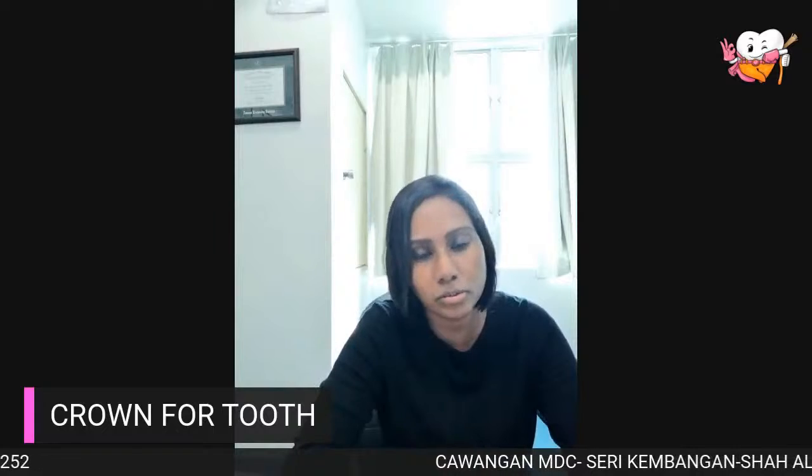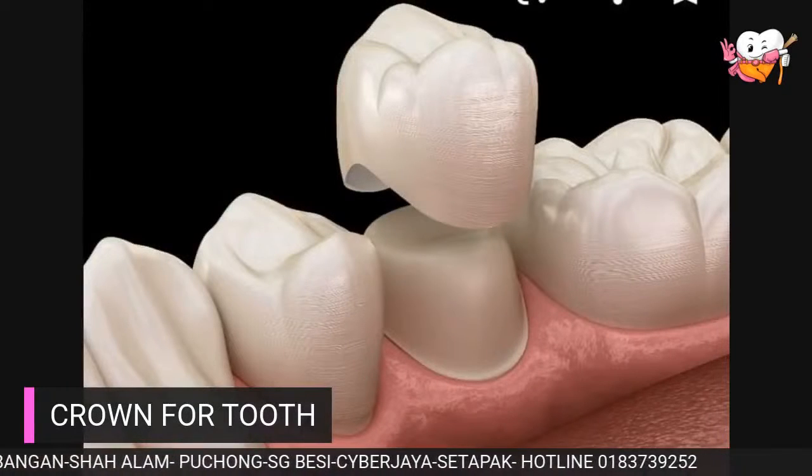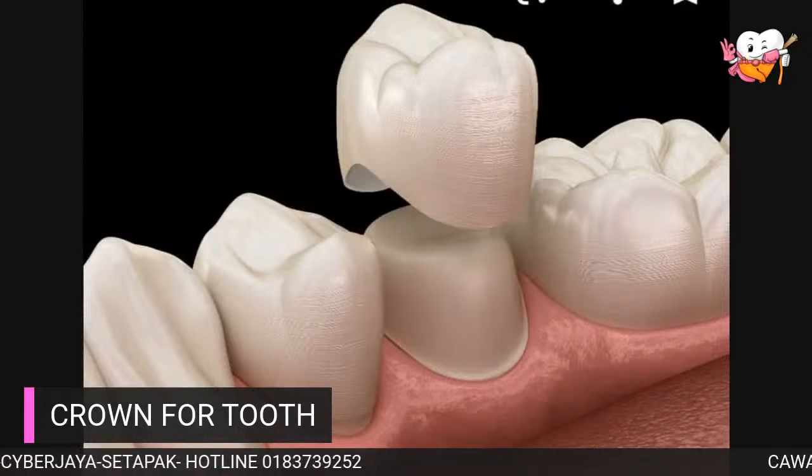Today, I would like to share small information regarding something which is very important for every patient to know, something about crown for a tooth. So, what is a crown? Can show the picture. So crown is basically a protection or a cap given for a tooth.